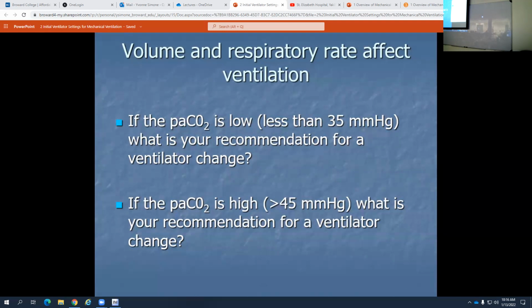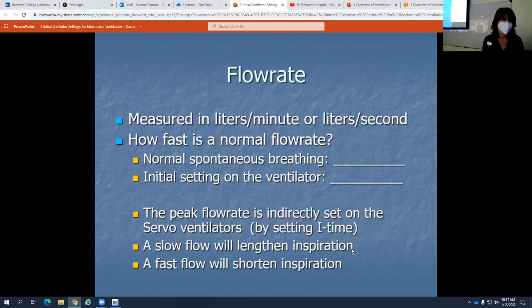Yeah, so here's the tidal volume that you figured out. Is this good for the patient's size, something like that? Kind of understand the process. Yeah, you have to calculate it and then apply it. That's correct. All right, let's keep going and make good use of time.